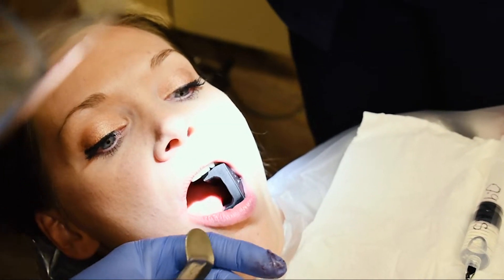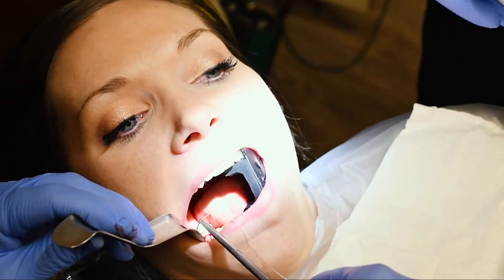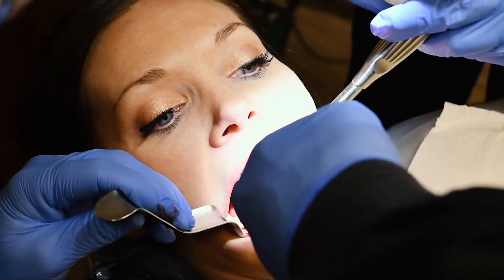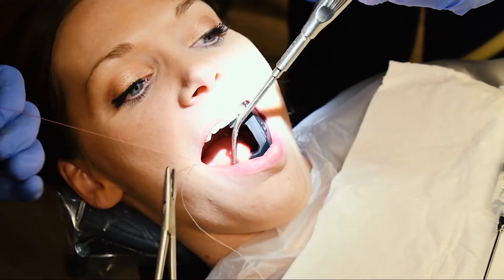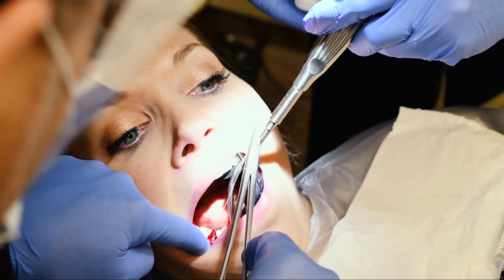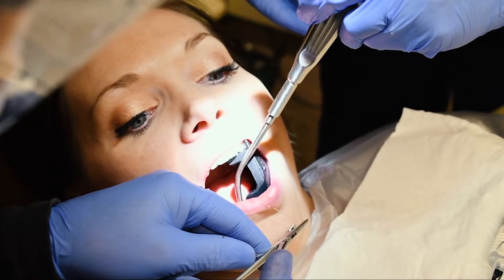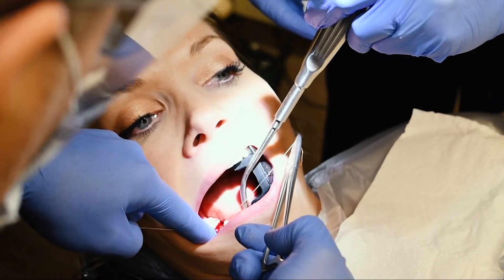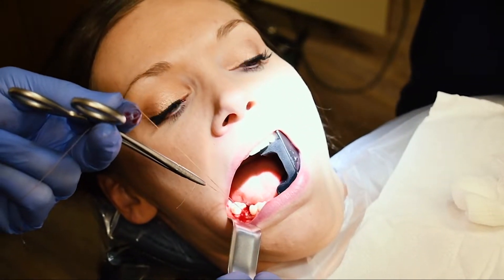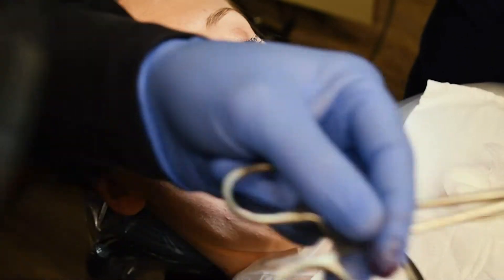He can retract the tongue over there. Vanessa actually did beatbox for me — that's pretty cool. She actually can beatbox — you've heard her, she's pretty good. This is a dissolvable suture — it comes out in three to five days. Just the stitch now.